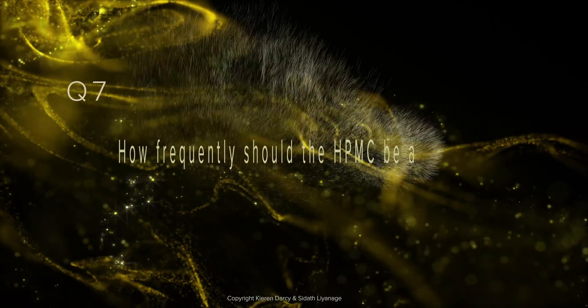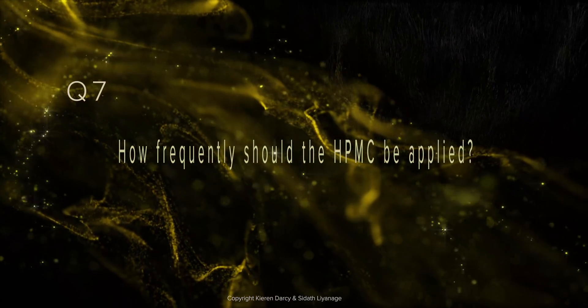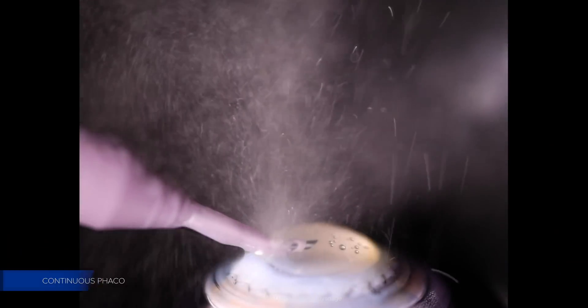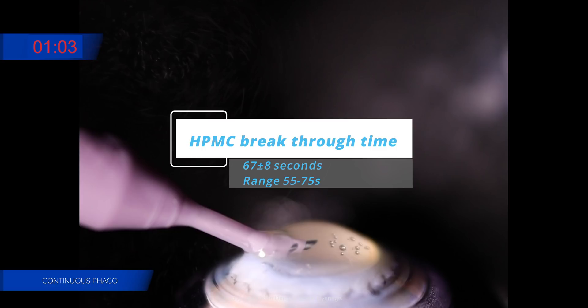Question 7: How frequently should the HPMC be applied? Repeated timing exercises confirmed the HPMC breakthrough time averaged 67 seconds, with a standard deviation of 8 seconds.